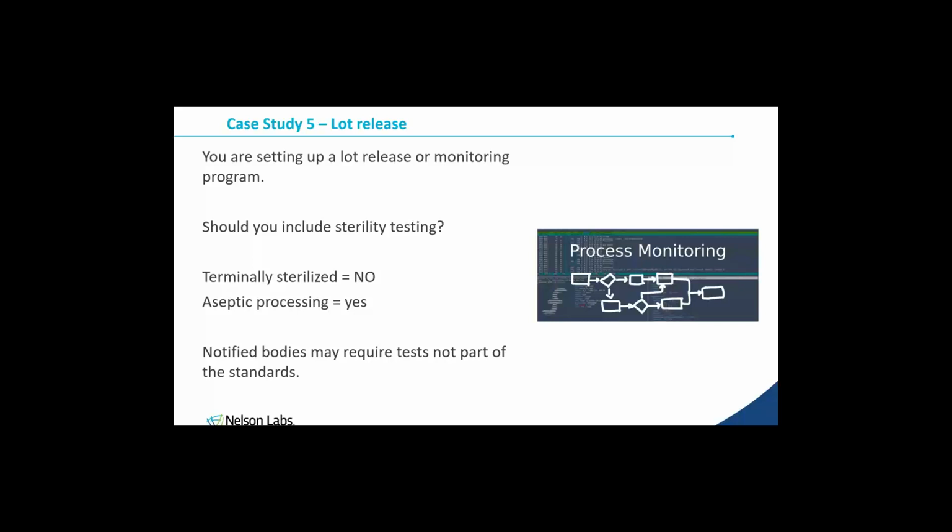We'll go ahead and do the testing, but be aware of what that means and be aware there isn't really guidance for you if there is an issue. If you have a positive and you call us up and you go, what do we do now? Well, no standard really says.